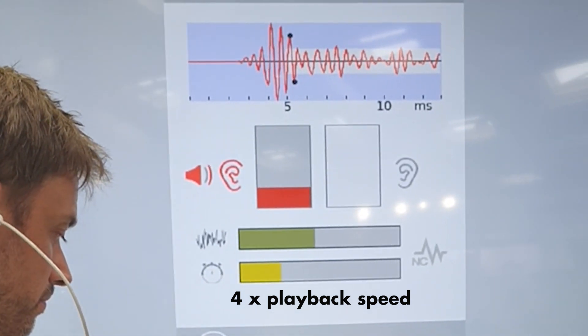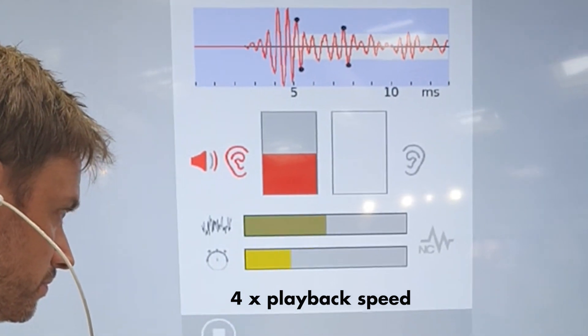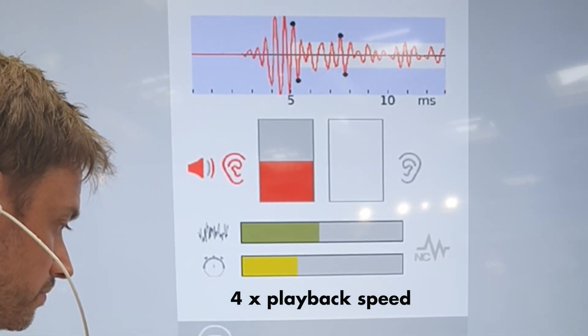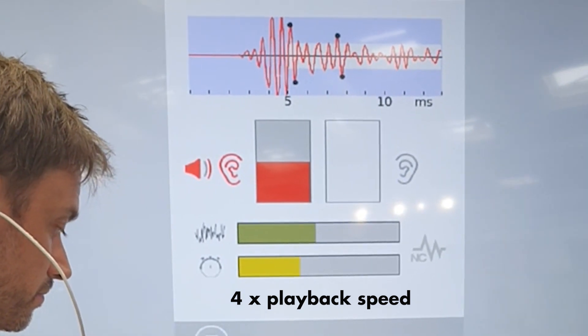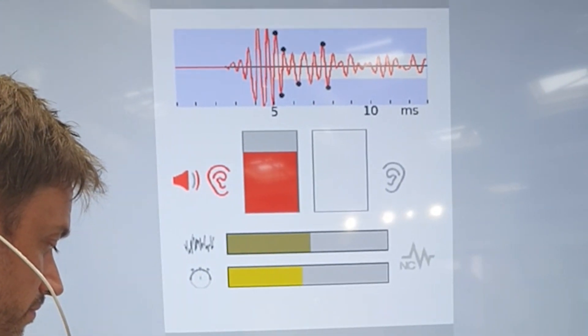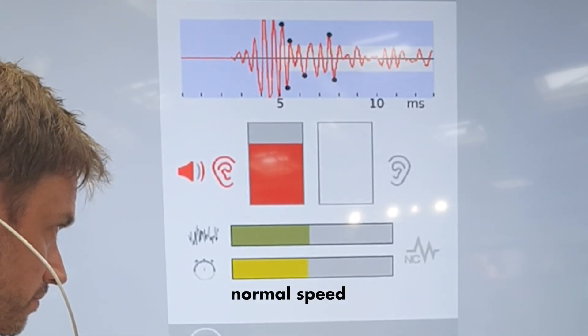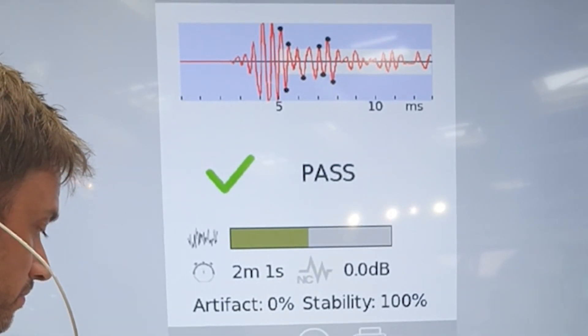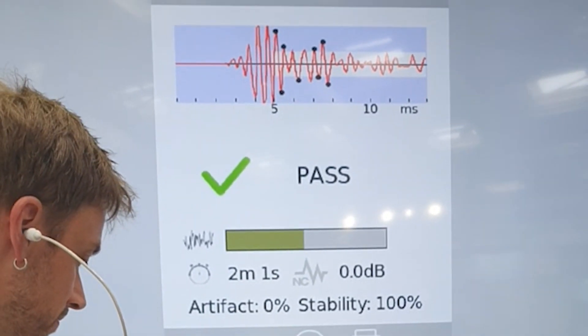The waveform is looking more defined as we take more averages, with the red box on the left denoting the right ear and the validation of the signal. We're running just over two minutes now — and there we go, we've got a pass at two minutes and one second.